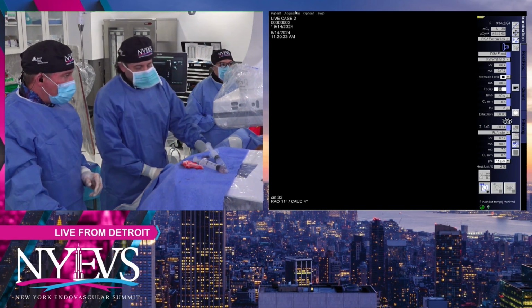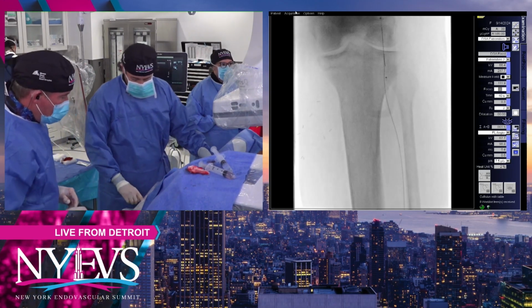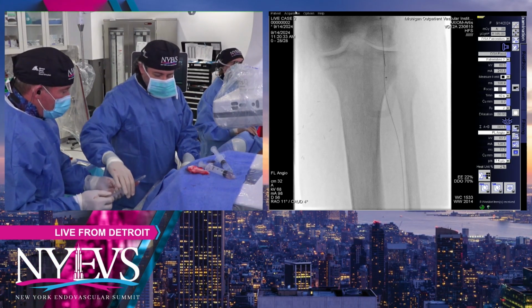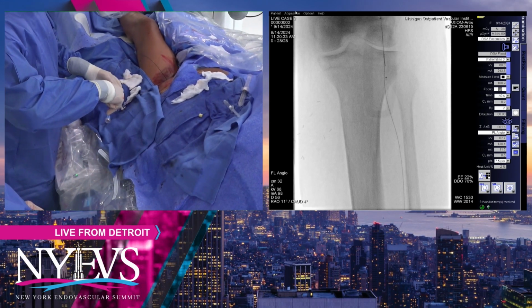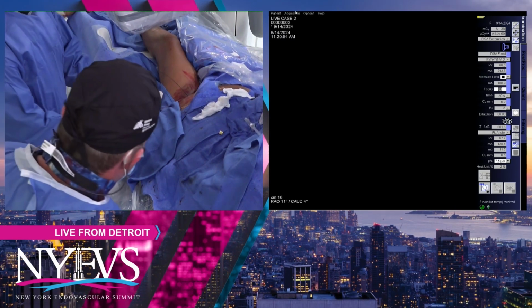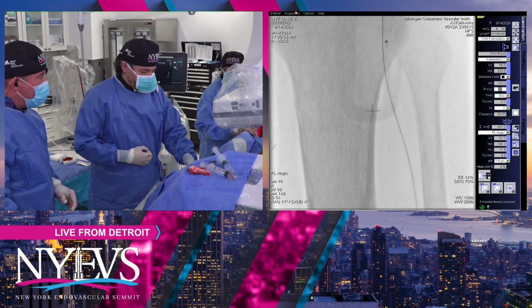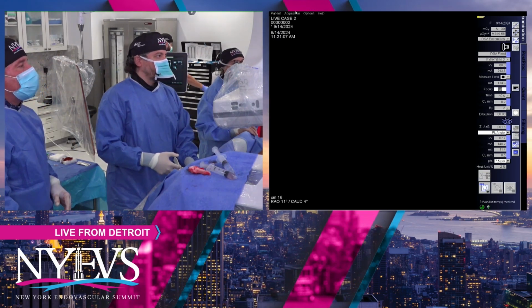So let me show you. Fadi, did you try to cross that from above? No, I did not. I did not want to mess up that vessel or mess around with any of those collaterals. So, in my opinion, retrograde wire approach is safer in those patients because of antegrade dissection. And I think if you saw my last case, you saw what antegrade dissection did with a 4mm vessel.